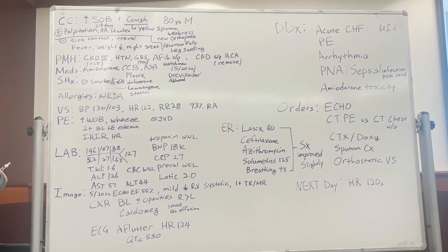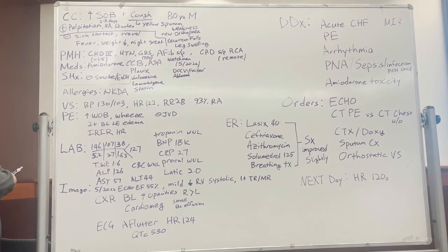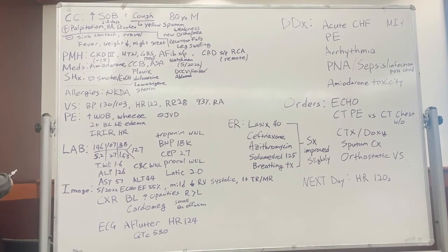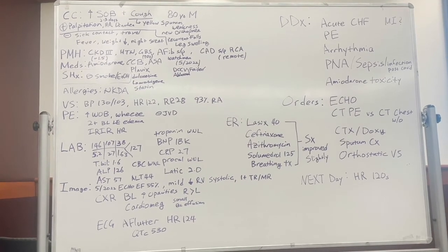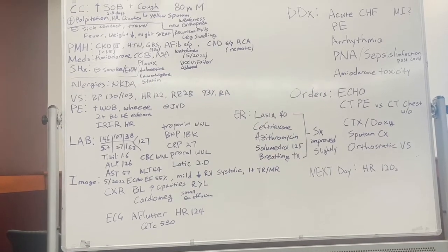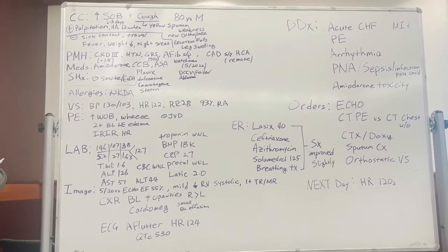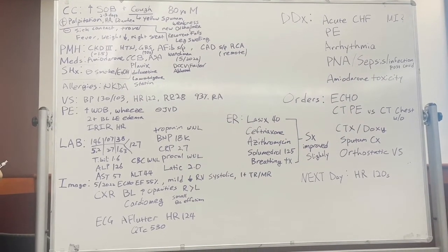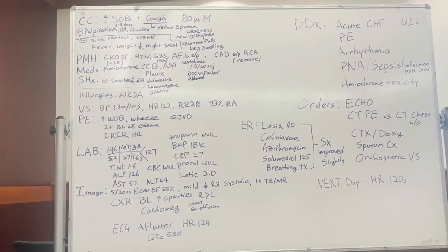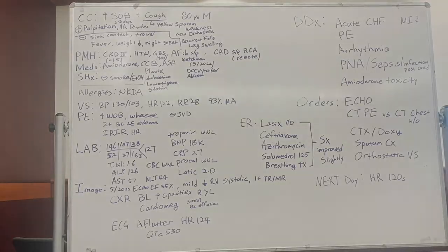Okay, so what do you think? You see this EKG, he's been tachy at 120s the whole time. He's on his amiodarone, right? If you have an 80-year-old on amiodarone, what should the rhythm be? I mean, you can use amiodarone for rate control, but if you're on amiodarone at 80, I hope you're in sinus rhythm. That's amiodarone's last line, right? This guy's had PVI, this guy's had cardioversion, and this guy's on amiodarone. So you would hope he's holding sinus rhythm, and again, I'm not so sure that this is a sinus rhythm. I think these are flutter waves. So, what do you guys want to do?